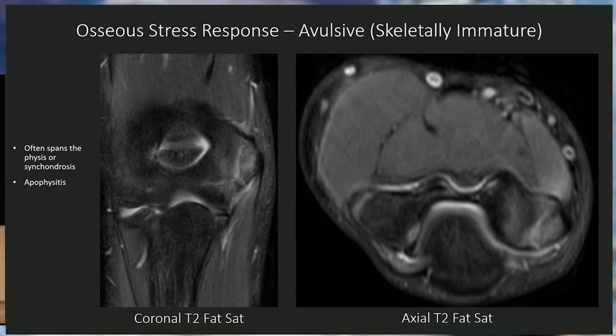Epiphyses can be asymmetric and very irregular normally, just as the patient goes through skeletal maturation. One of the things I mentioned in the lecture was an entity called, and I think this is a funny name because it's a long name and very descriptive, but a mouthful to say, normal developmental irregularity of the femoral condyles. Basically, that says there is a normal developmental variant as the skeletally immature patient matures in the femoral condyles that can be misdiagnosed as an osteochondral lesion.